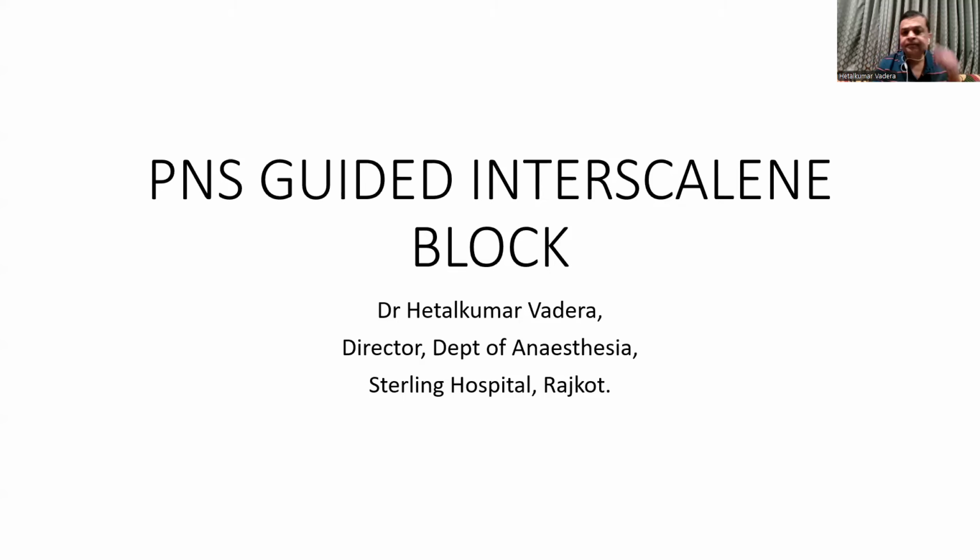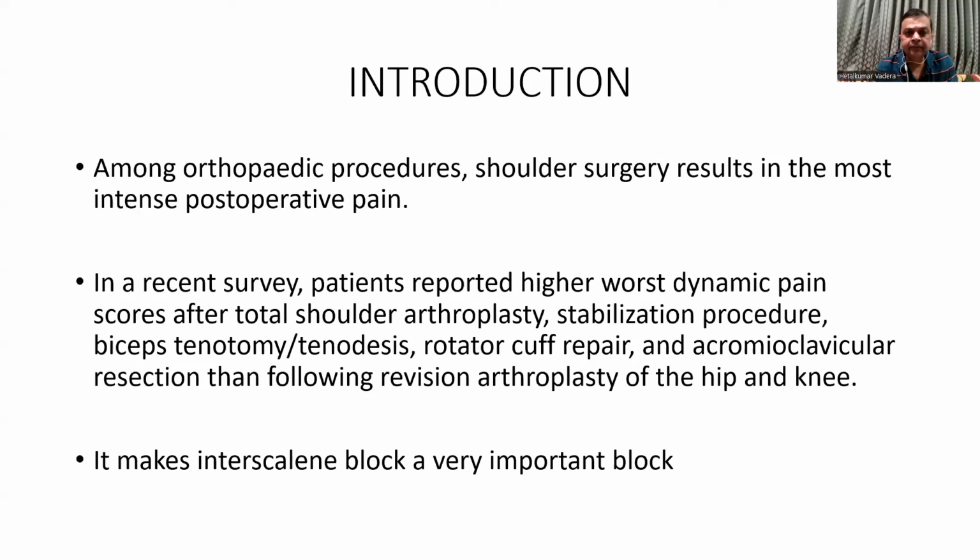In the recent era, ultrasound has replaced PNS at most places across the globe. But in our country, India, getting an ultrasound machine is really difficult, especially for freelancers. So PNS is still relevant in our country, and we should know how to give PNS guided blocks.